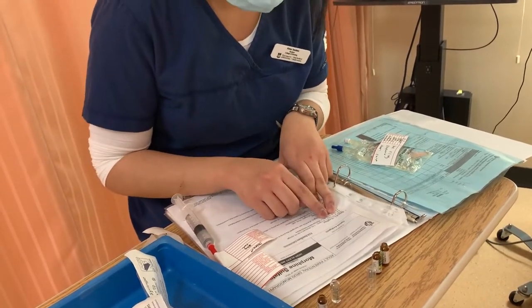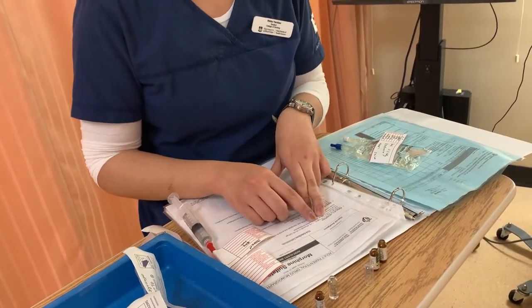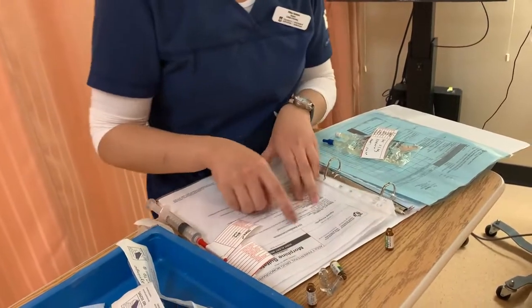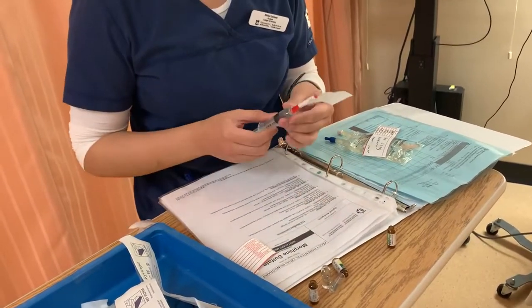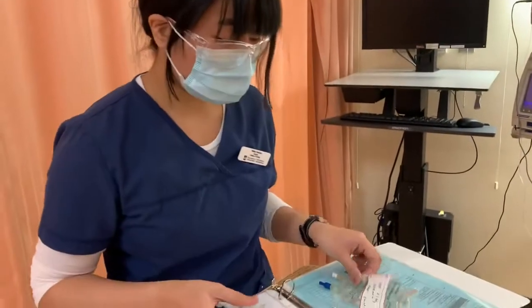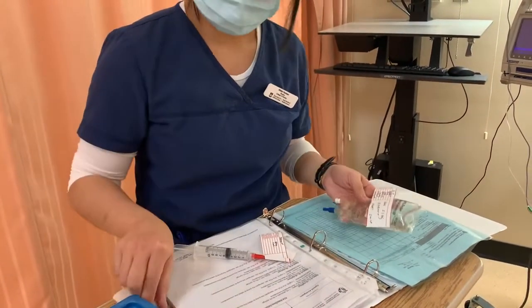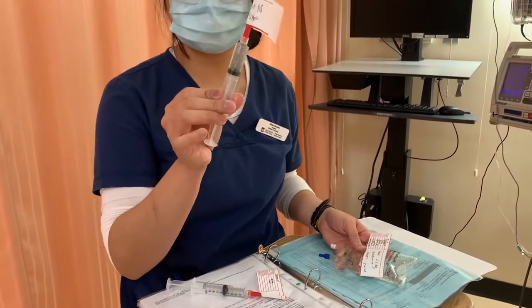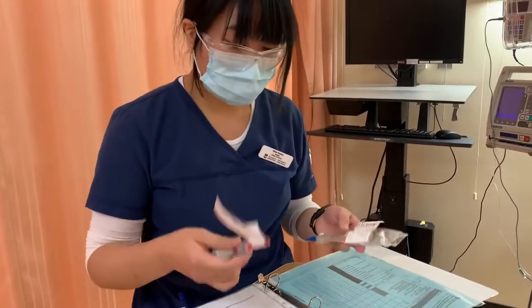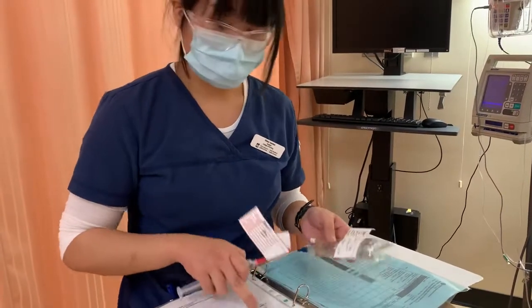So we need to draw up 50 milligrams of medication, and that would be 5 times the 10 milligrams per ml. I checked that they're all 10 milligrams per ml in here, so we should have 5 ml in our syringe right here. We also have to have 45 ml of normal saline. We have already drawn up our excess normal saline here. It says 5 ml, so we know that there is only 45 in the bag, and when we combine them all, we will have 50 ml in final volume and a final concentration of 1 milligram per ml.